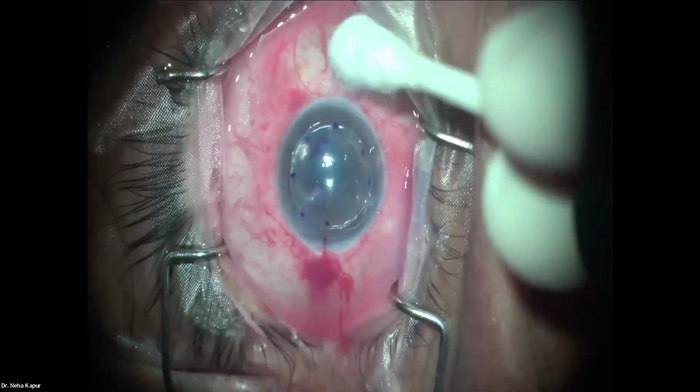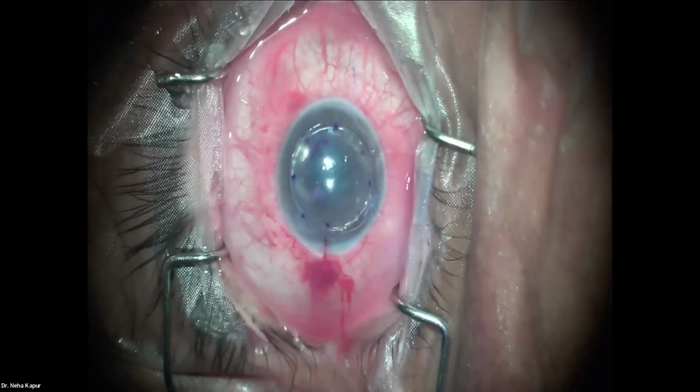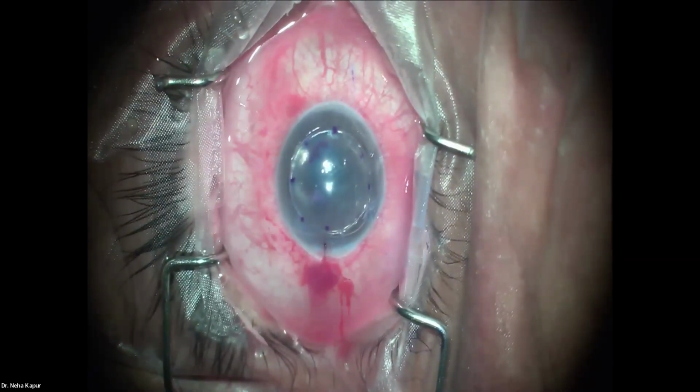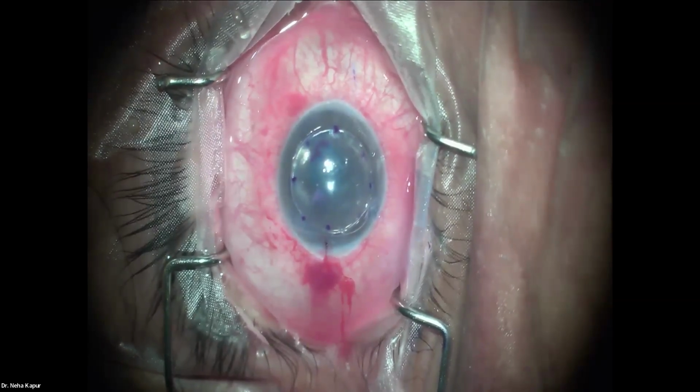We see the double ring sign. We see the eye. It's looking good. The lenticule is exactly where we'd like it to be. We'll put 2 more sutures, one on either side of the central suture. Allow 10 minutes of rest time for the lenticule to stick.